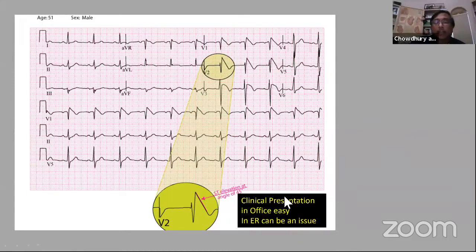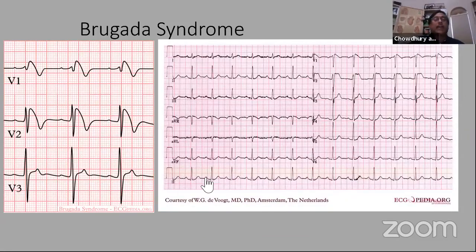And again, look at this right-sided corner. If you are seeing this patient in the office for chest pain for the last 3 months or palpitation for the last 3 months or symptoms, nothing acute going on, please don't send the patient by ambulance to the emergency room. We had that problem. The patient was sent because the doctor got worried with this EKG. Patient was fine. Doctor was worried. And then recognize these several types. This talk is not for that, but there are several types of Brugada, and those who are in cardiology need to know what the channelopathy is and all that.